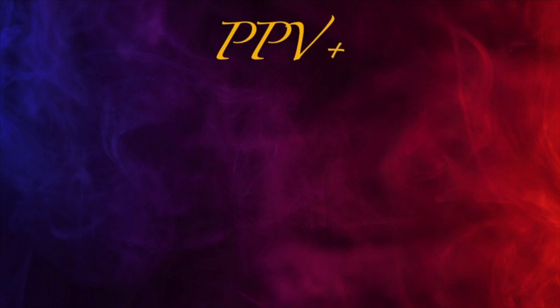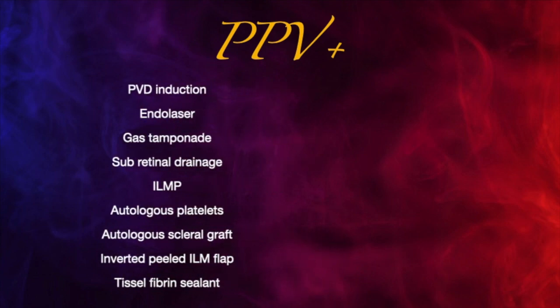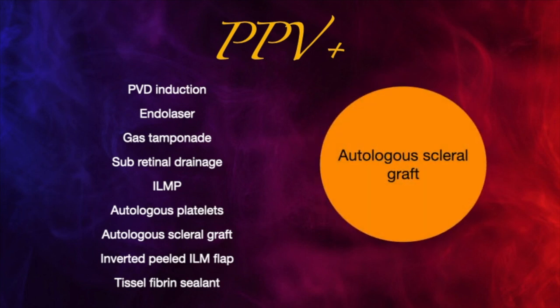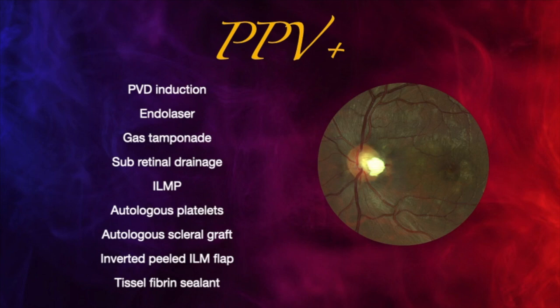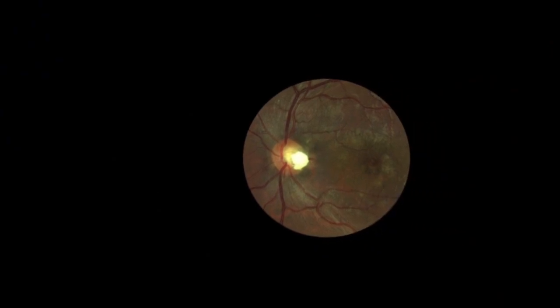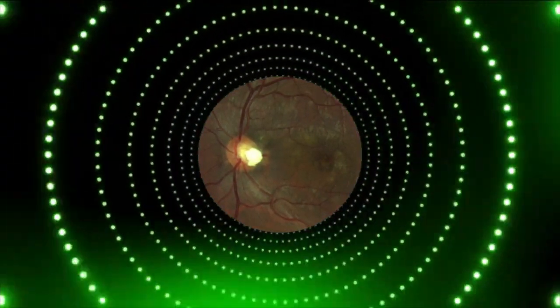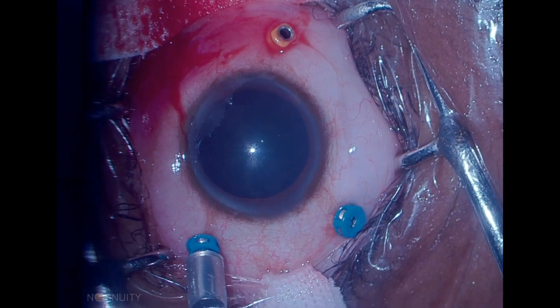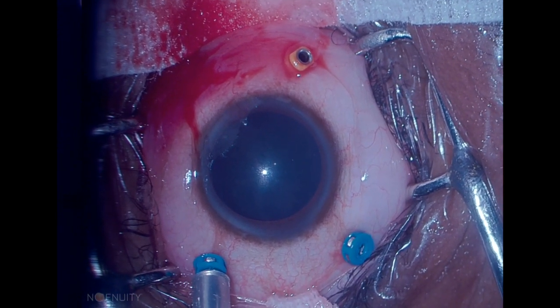There are reports of visual improvement using one or more additional procedures, and in our patients we use autologous scleral graft to seal the optic disc pit during surgery to prevent passage of fluid into the intra and subretinal spaces. And so this scleral graft is the hip hopper we are talking about, and in this video we will see why it is so.